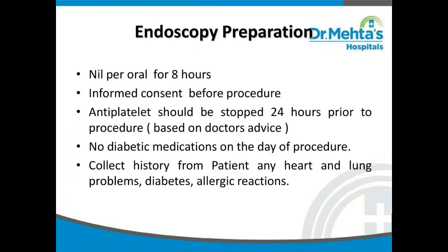How do you prepare the patient for endoscopy? Keep the patient nil per oral for 8 hours. Obtain an informed consent prior to the procedure. Antiplatelets, if any, should be stopped 24 hours prior to the procedure based on doctor's advice. No diabetic medications on the day of the procedure. And collect history from the patient regarding any heart or lung issues or even allergic reactions.